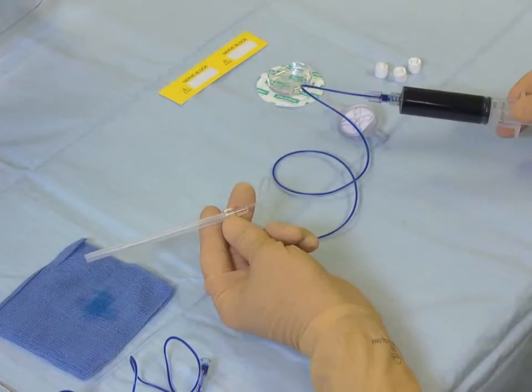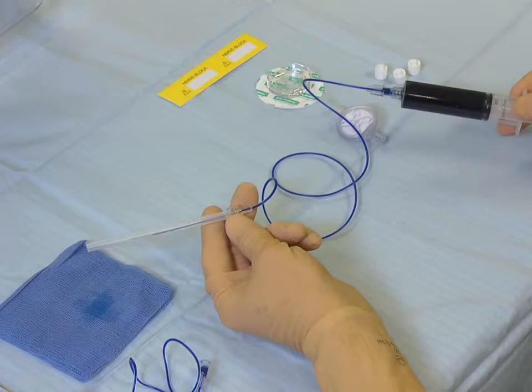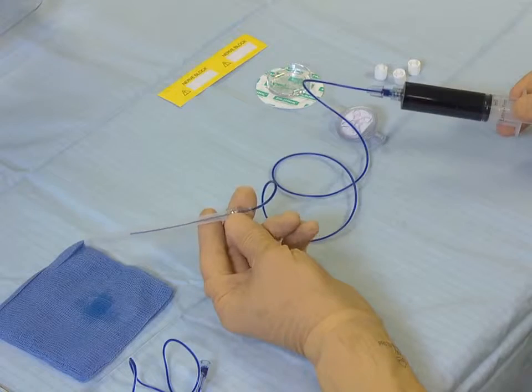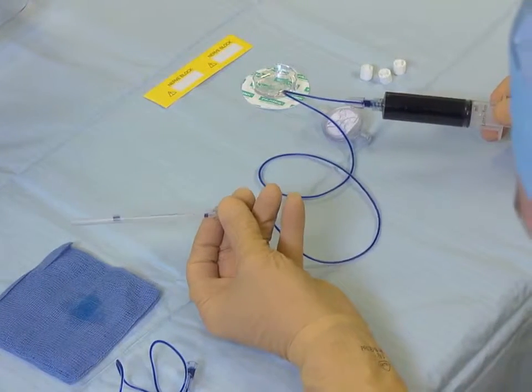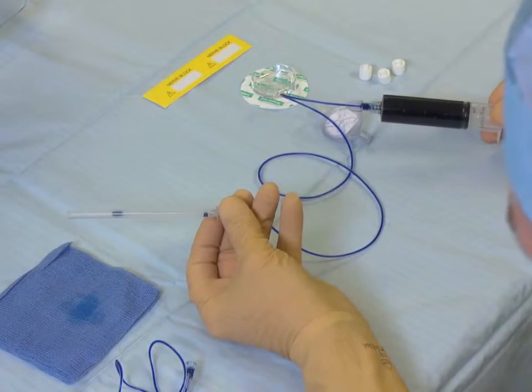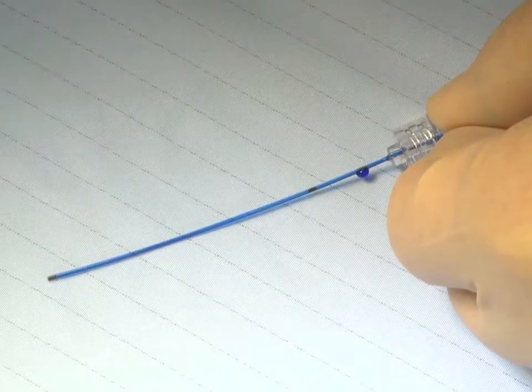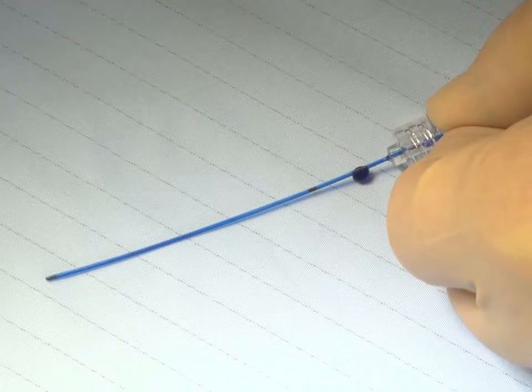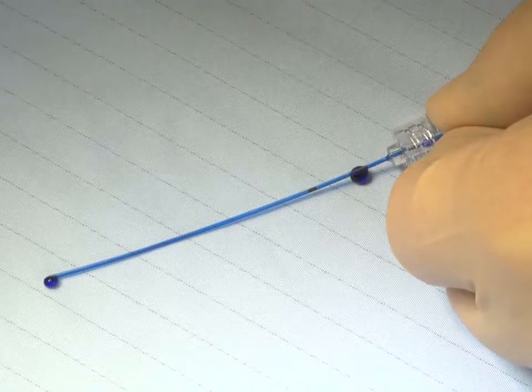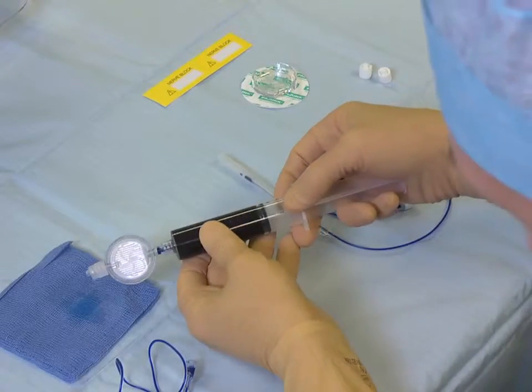Prime the E-Cath itself. Again, you will see fluid exiting from the proximal and the distal points of the catheter. Next, prime the filter to ensure that all air is removed.